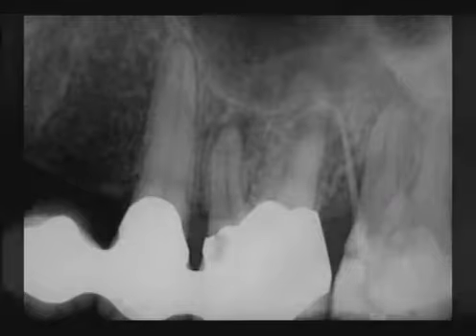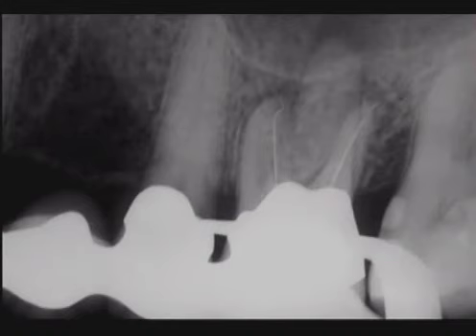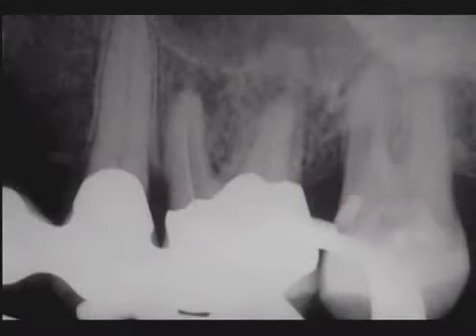Let's take a look. In this straight-on view, you can see that we've pre-flared the MB canal, and now a pre-enlarged canal can accommodate a pre-curved file to length. Notice the 10 file in the distal buccal to length. In this working film, taken from the distal, you can see we've isolated the MB root more anteriorly. In a pre-flared canal, notice the 10 file working through the MB2 and to length.